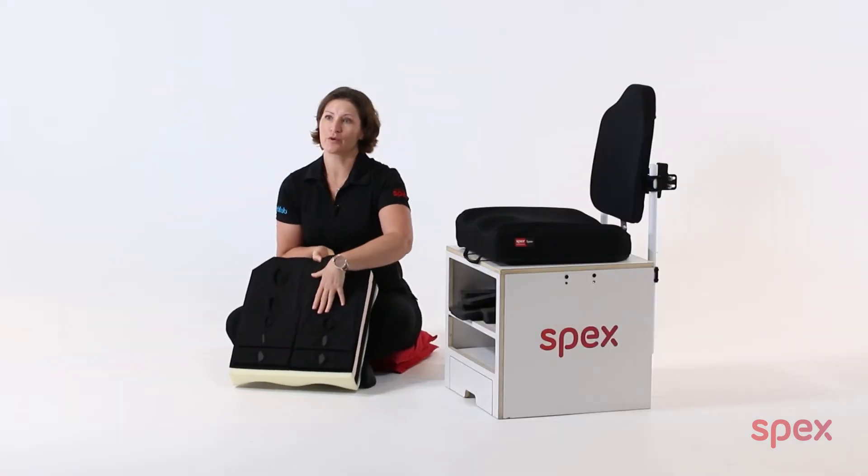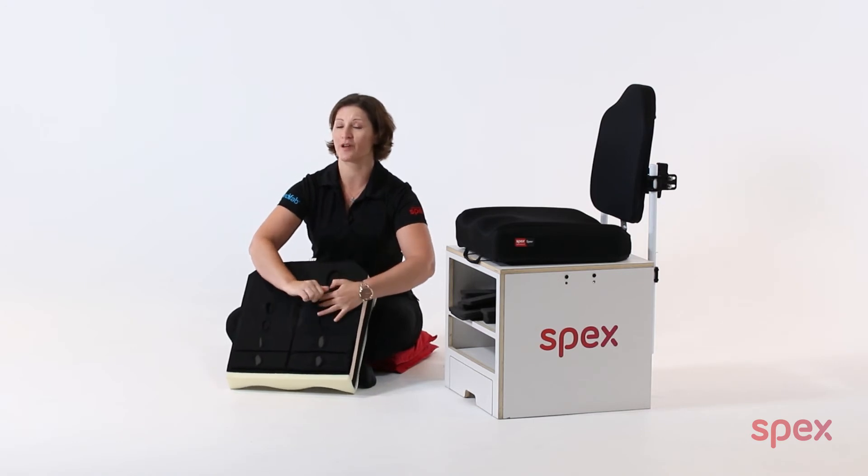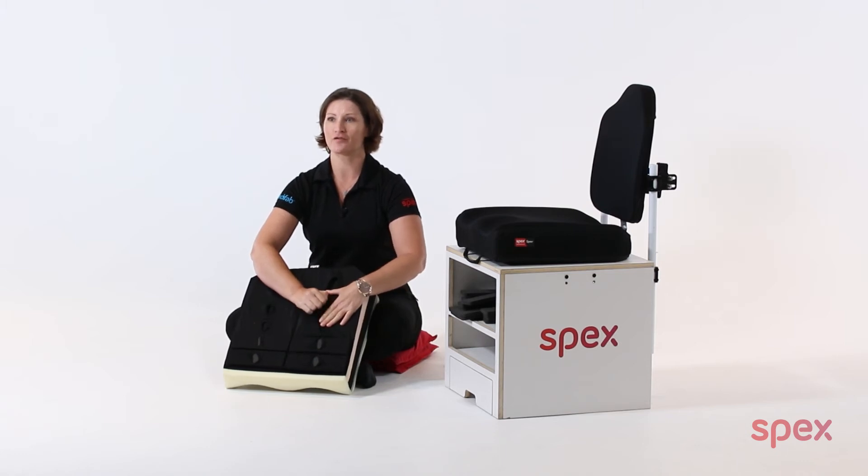A helpful tip when contouring the strategic positioning base is to stretch the fabric pockets with your fingers before trying to add multiple pads in. This will allow for easier adding and subtracting of pads.